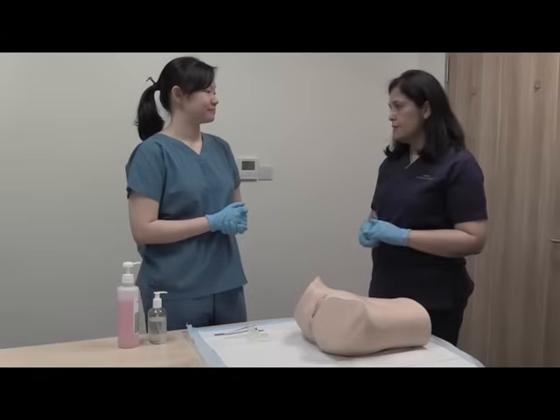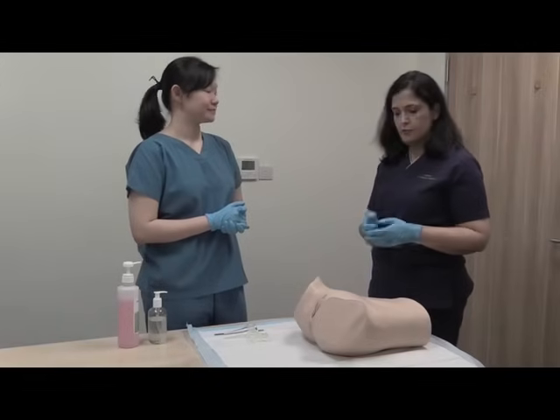Hello. Today in this session we will practice a basic gynae examination of this pelvic model.